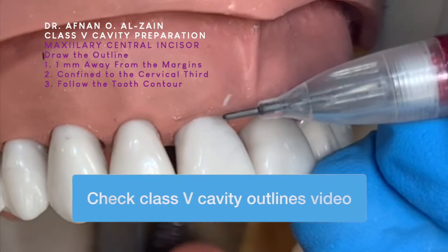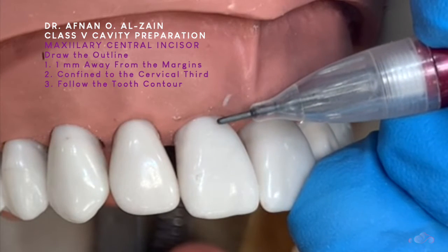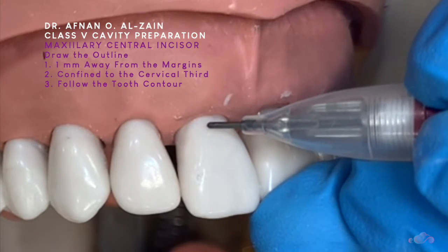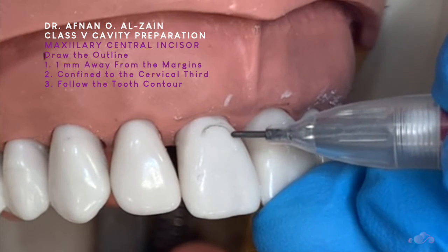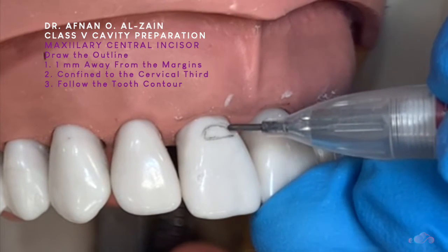The first thing is to draw the outline for class 5: 1 mm away from the gingival margin and 1 mm away from the proximal margins. It follows the contour of the tooth and then a straight line from the incisor.